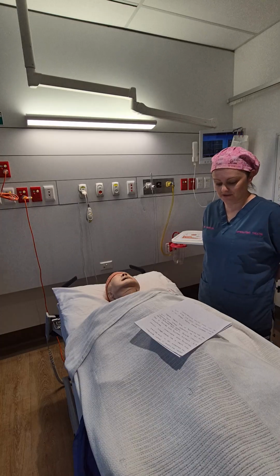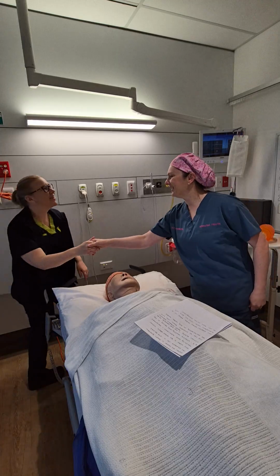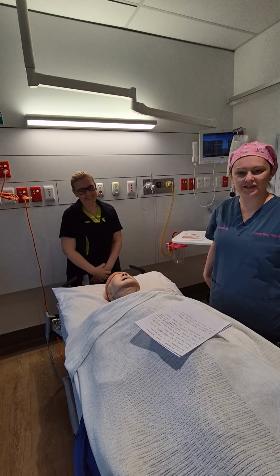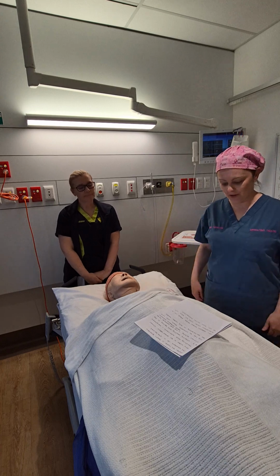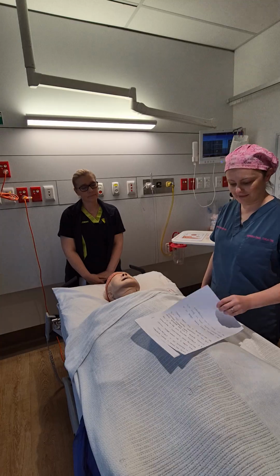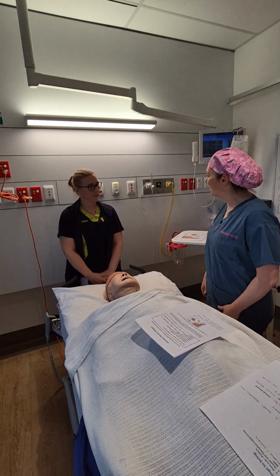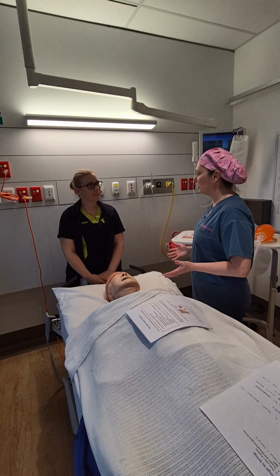So to begin with, I'd just like to introduce Sarah, she's a student nurse. Hi, nice to meet you. In our video today, our session takes place in a simulation room, and our focus will be on basic airway management. So, hello Sarah, thank you for attending the session today. No worries.